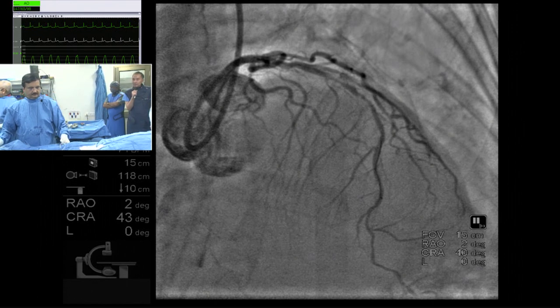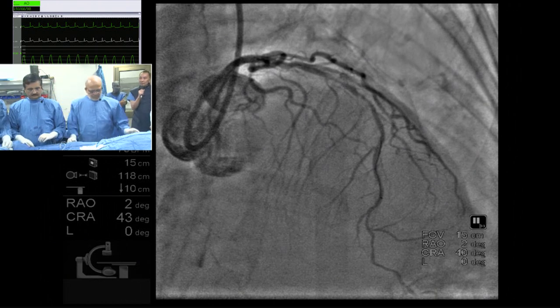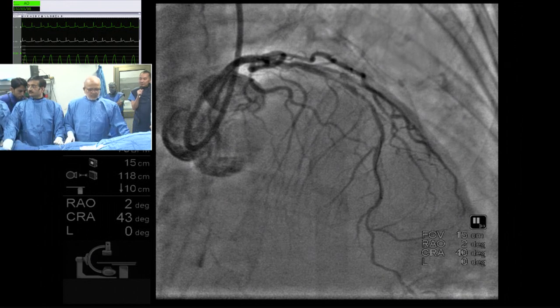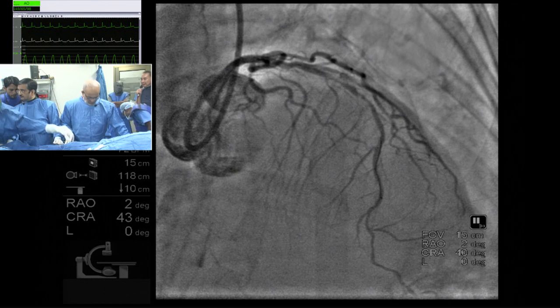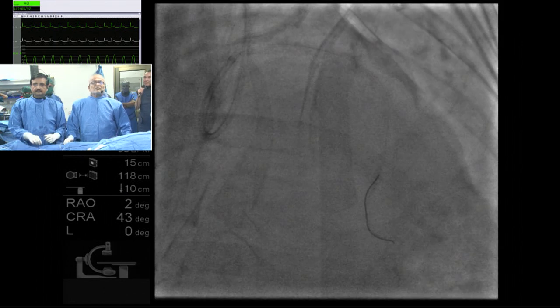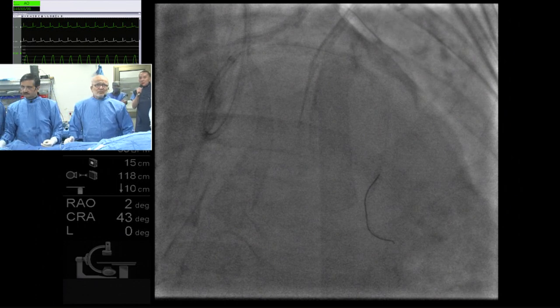is really stuck, you can also cut the shaft of the burr, if worse comes to worse, and advance a guideliner. The guideliner will allow you to get closer to the burr and help you release it. Yeah, I think cutting the burr is the last solution.